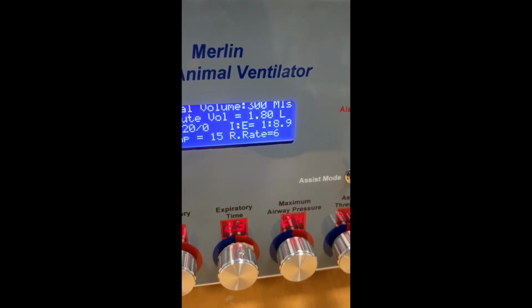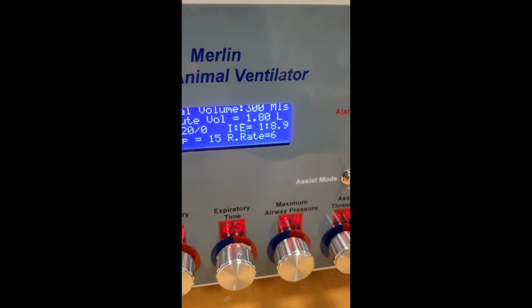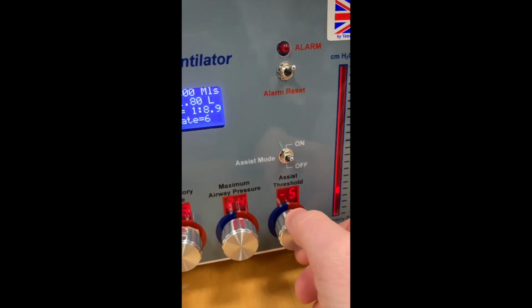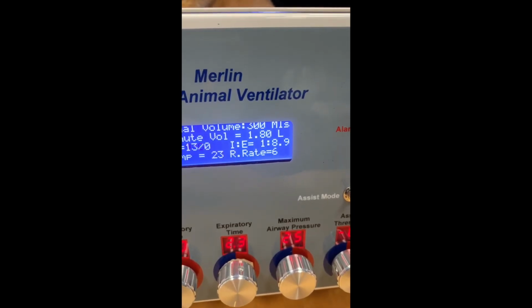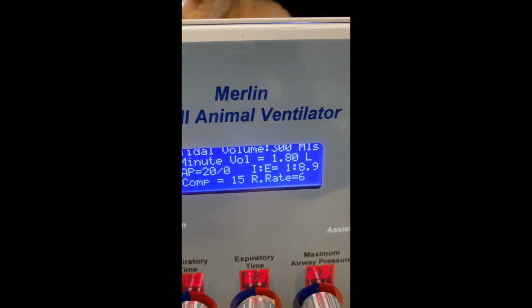Now Rover can't take a breath, so I'm going to just disconnect Rover and simulate the breath myself by drawing in on the inspiratory airway. I'm going to change the threshold to -8 just so we can see on the screen more clearly the effect. Just wait for the next breath. Okay, so now I'm going to breathe in and we'll see the airway pressure on the screen.